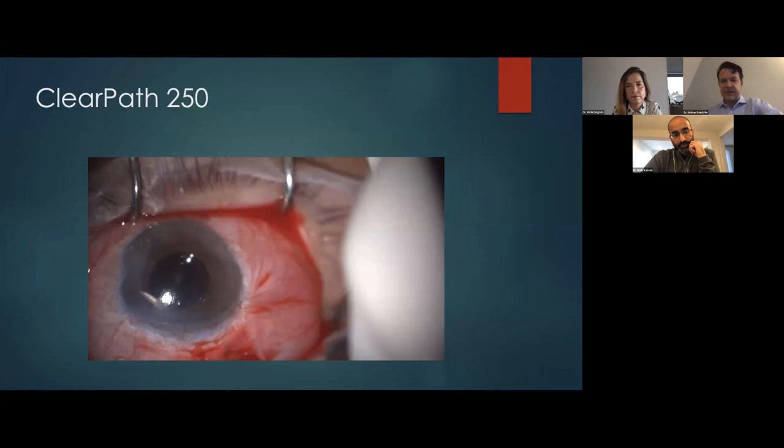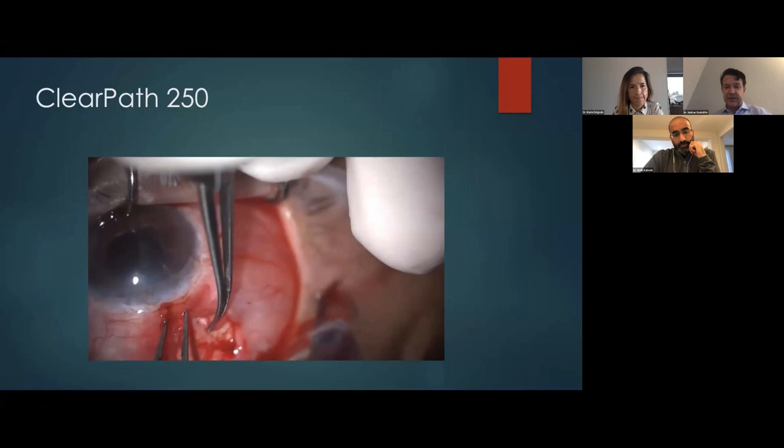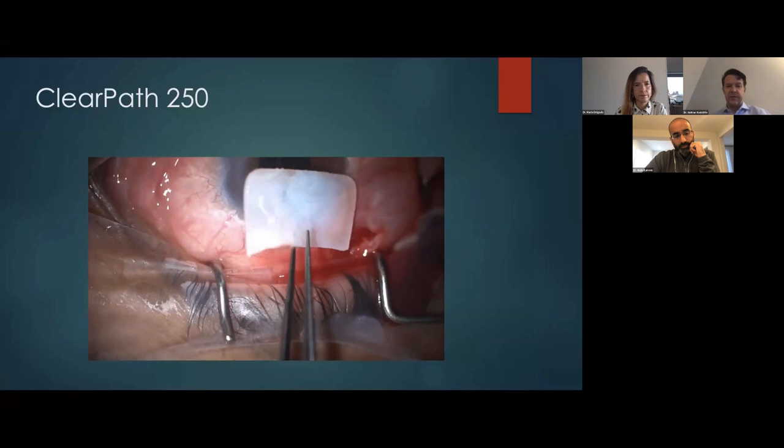But here I am, I'm in the sulcus, I'm coming out. By the way, I do feel that the clear paths do very well in the sulcus, and that's because there's no flow initially, and so you don't have to worry as much about iris clogging. And everything's a little bit more stable at week 7 when that Vicryl dissolves and the pressure comes down, so you don't get clogging of the iris in the tube quite as often.